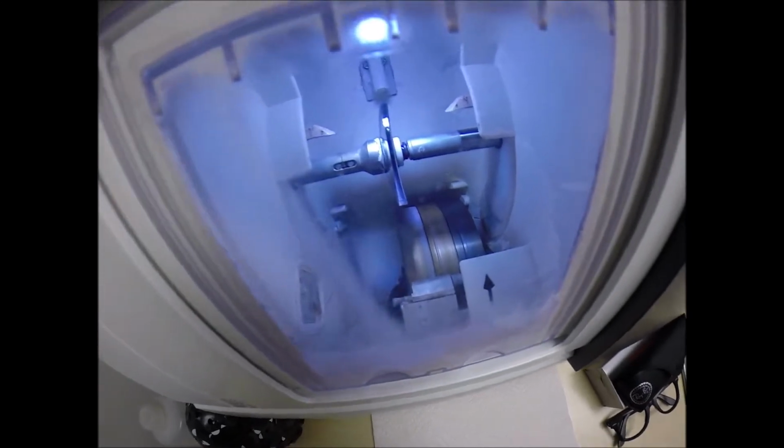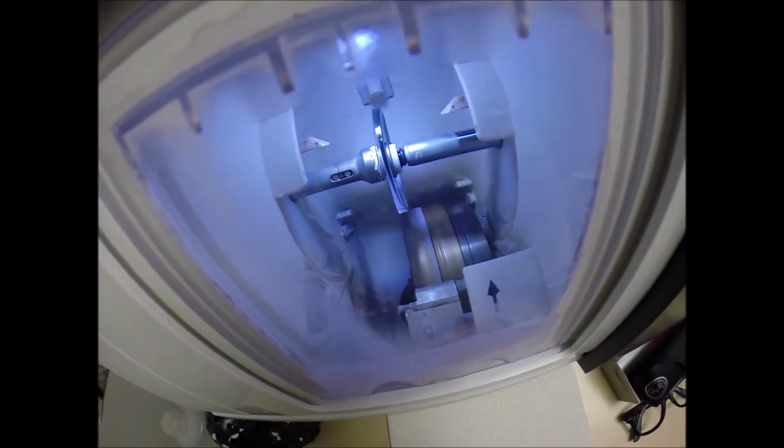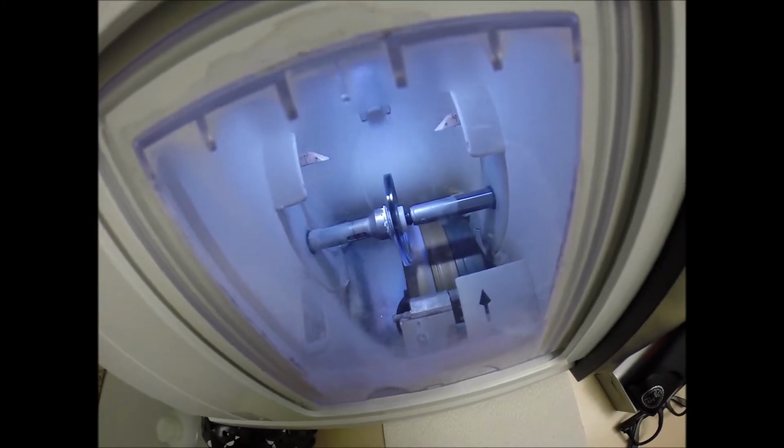And then the cutting wheel is going to speed up. The lens is going to drop down onto the cutting wheel. The light you see flickering in the background is water to catch the optical sawdust as it comes off the cutting wheel. Polycarbonate lenses cut dry, whereas plastic, high index plastic, and Trivex lenses cut wet.